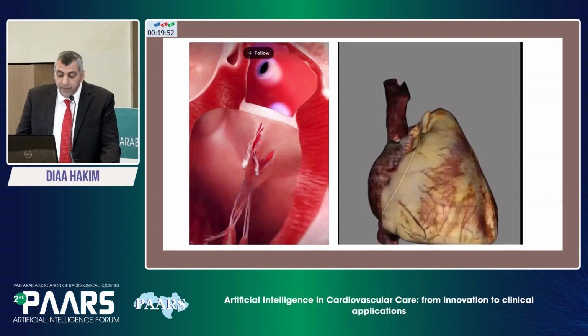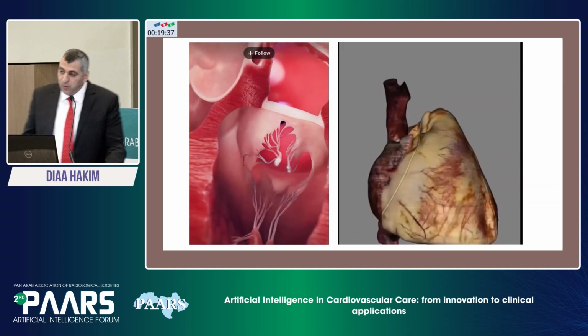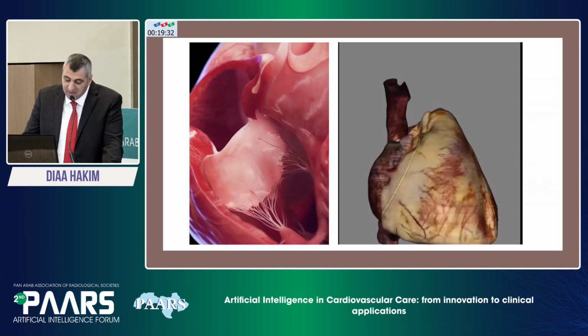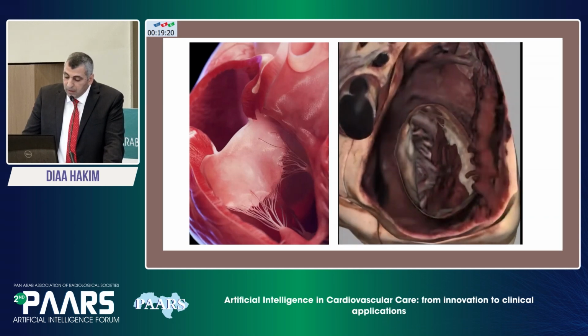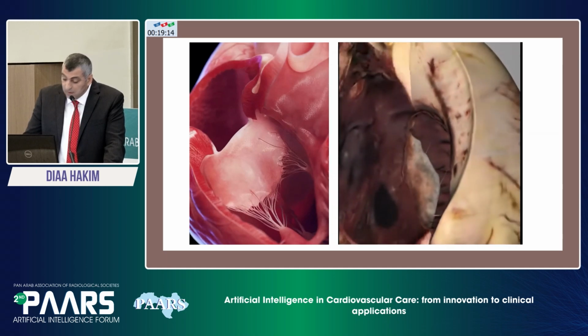And finally, the last thing is the use of AI-enabled programs for disease analysis or analysis of the causes of the disease, including, of course, the virtual assessment, as you can see here, like a fancy cinematic view of the mitral, the tricuspid valve and the aortic valve, and use it for evaluation of the anatomy and the pathology. That will help us to diagnose the disease and understand the mechanism or pathology behind it.